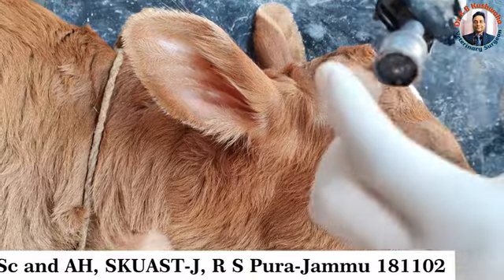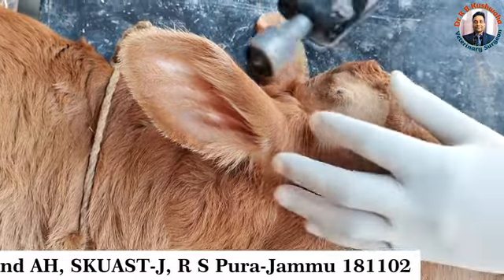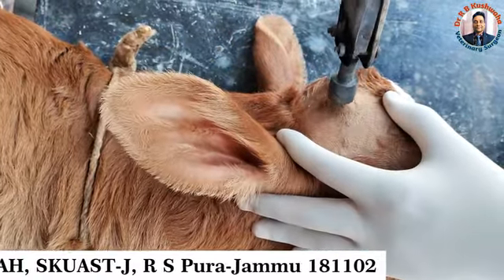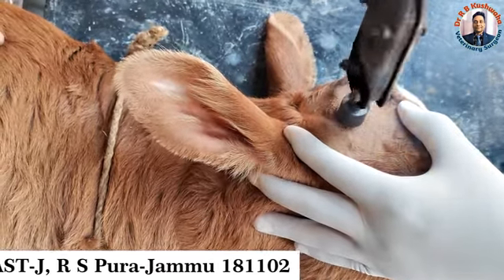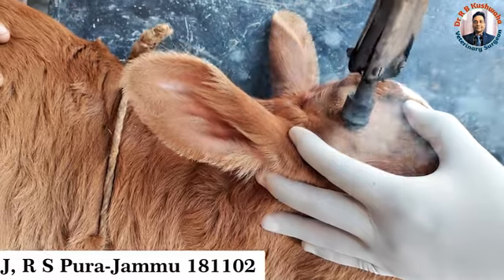This is an electrical disbudder, but we have put it on a flame to act as a thermal disbudder. Now you can see we just keep it around the bud and simply rotate it.